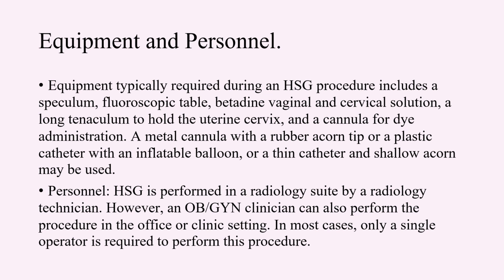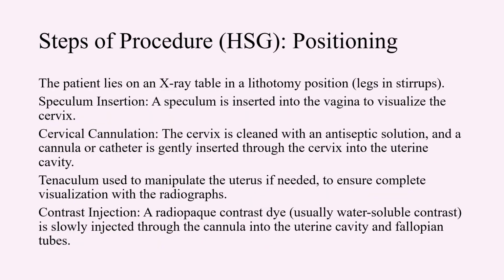The procedure is performed in a radiology suite by a radiology technician. However, an OB/GYN clinician can also perform the procedure in the office or the clinic setting. In most cases, only a single operator is required to perform this procedure. The patient is placed on an X-ray table in a lithotomy position.